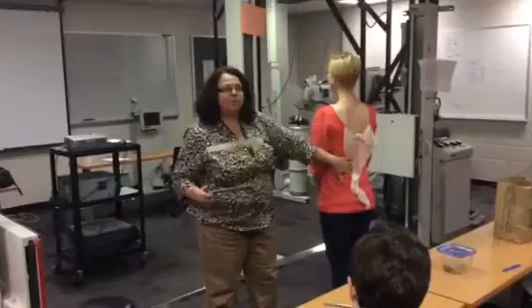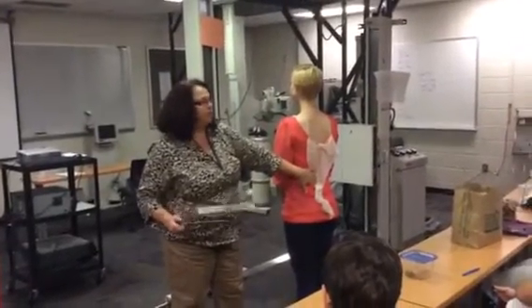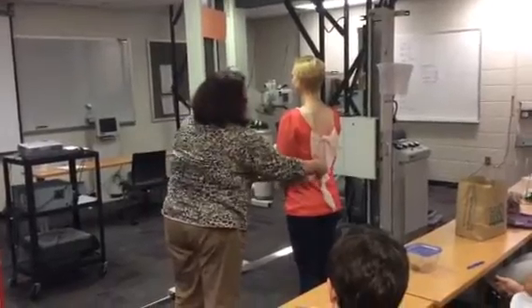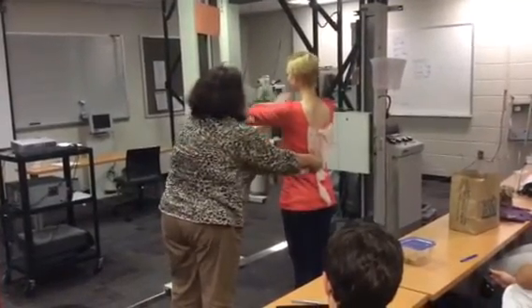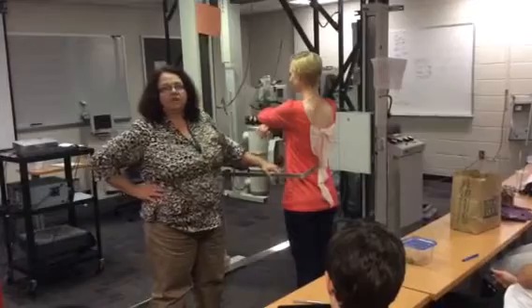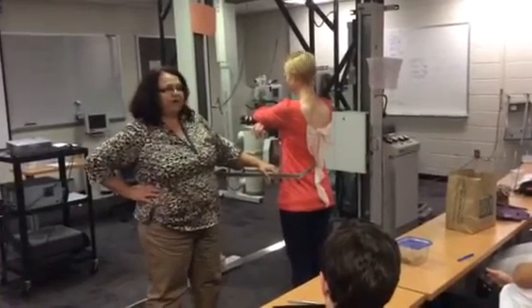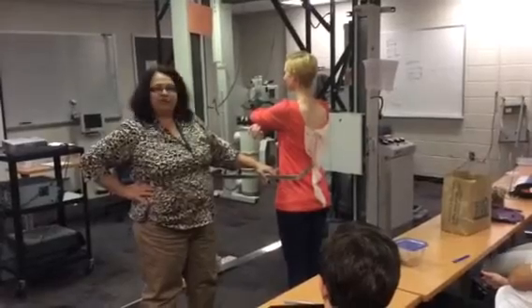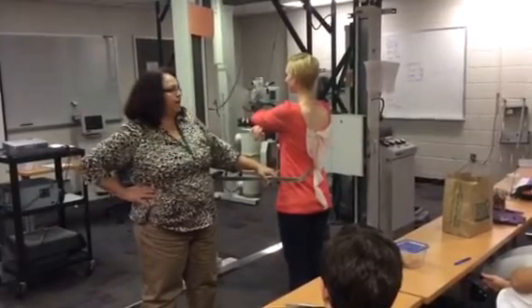Your central ray is going to pass through the spine, whether it's anterior or posterior oblique. So I'm going to start with my caliper on the spine. Lift your arms up, please. And then rotate the caliper 45 degrees. That's the path the central ray will take through the body. It says measure obliquely, and that's what you're doing, is you're measuring that oblique path through the body.